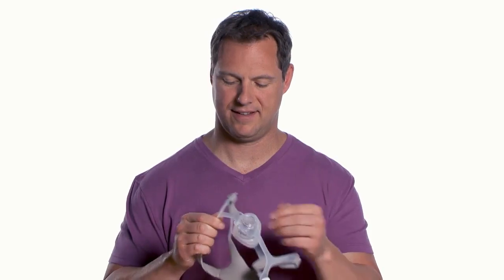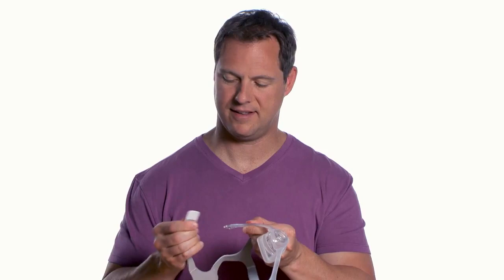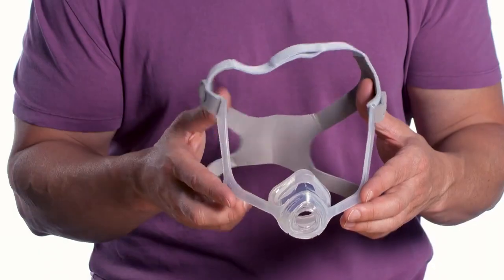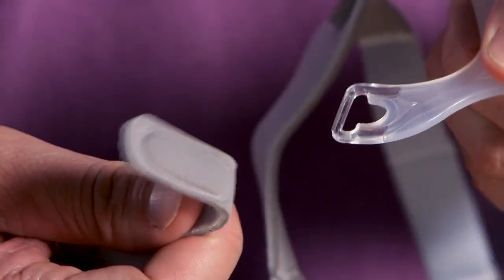To put on the mask, disconnect one or both of the headgear clips by gripping and twisting them away from the frame. Wisp is designed to be used with and without headgear clips. If you are not using clips, pull the tabs through the slots in the mask frame.